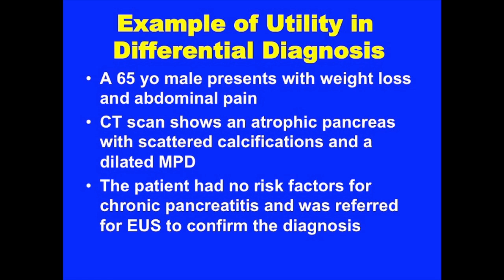The differential diagnosis, I think, is where EUS plays a very major role still. We still are capable of defining small tumors more readily than other imaging studies, MRCP, even CT scan, when they are small. And the literature from recurrent acute pancreatitis tells us that neuroendocrine tumors need to be considered in that differential diagnosis. And of course, the differential is recurrent acute versus chronic pancreatitis. So it comes into play there very much so.